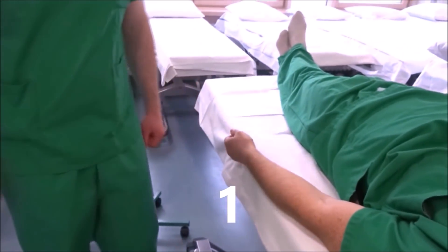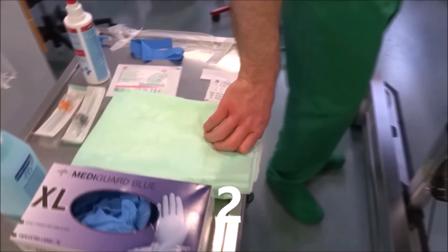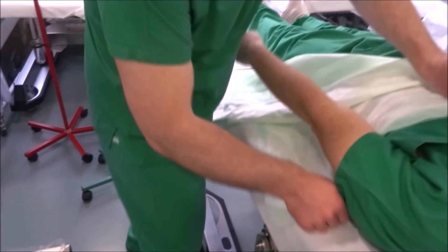Inform the patient first, then if not already done, we will install them on a lounger, a bed, or a chair. We put a bed protection under the puncturing extremity. If we already have to touch the patient here, we will do a hand disinfection before.